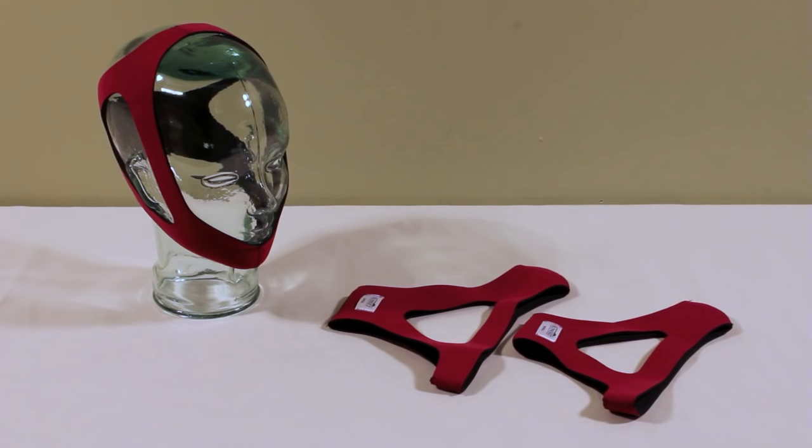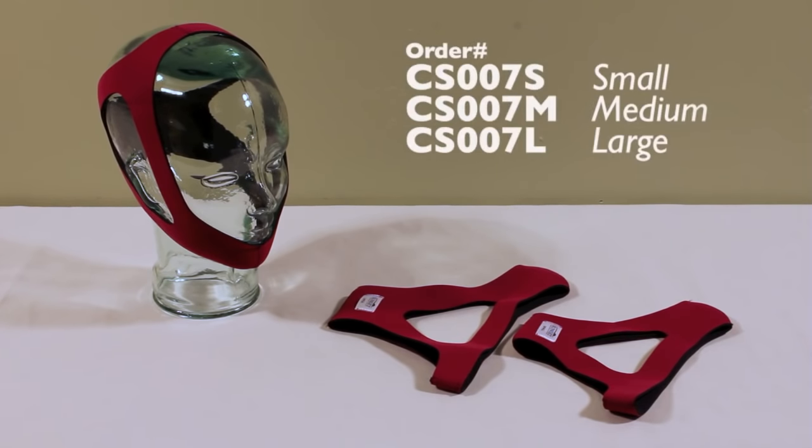The ruby style chin strap is made entirely from one piece of soft latex free neoprene and comes in sizes small, medium and large.